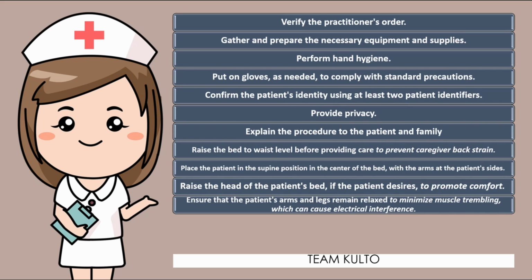So what you're gonna do is instruct your patient to put his or her hand on the side and avoid doing unnecessary movements and just relax, okay? Most probably yung ECG kasi natin nagte-take lang yan ng 5 to 10 minutes kasama na yung application. All in all, simula sa pag-i-explain ng procedure sa pasyente, okay?